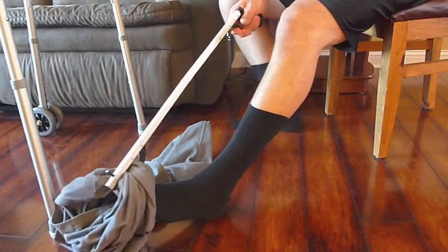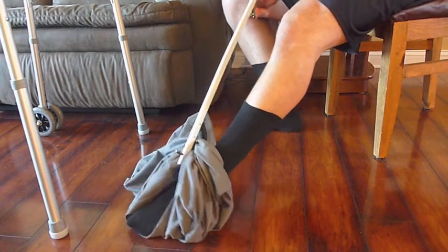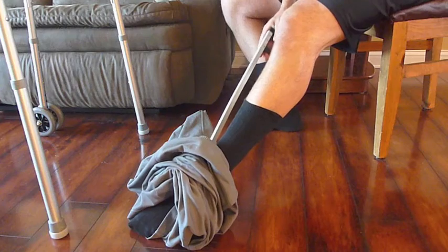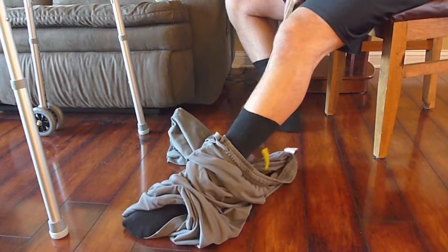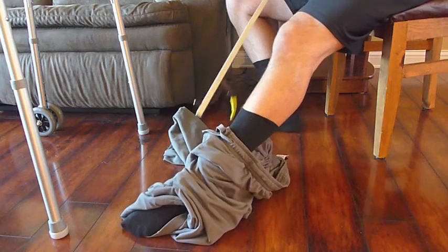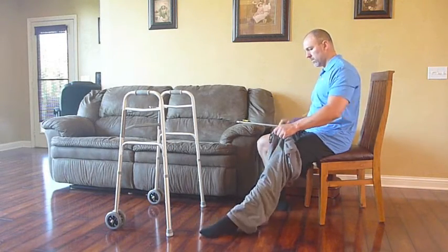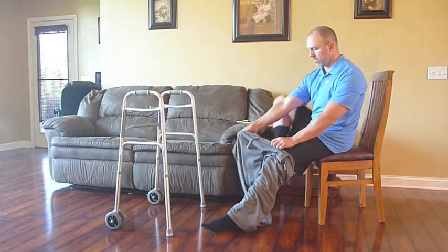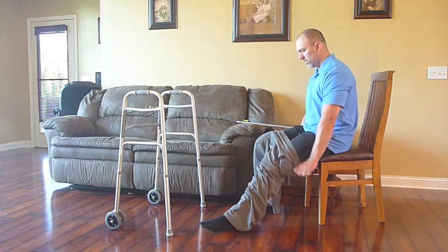Use the reacher to thread your injured leg through the pant leg. Adjust as needed to get the foot fully through, and then pull with the reacher to raise your pants up past your knee level so as to avoid reaching past your knee and compromising any precautions you may have.